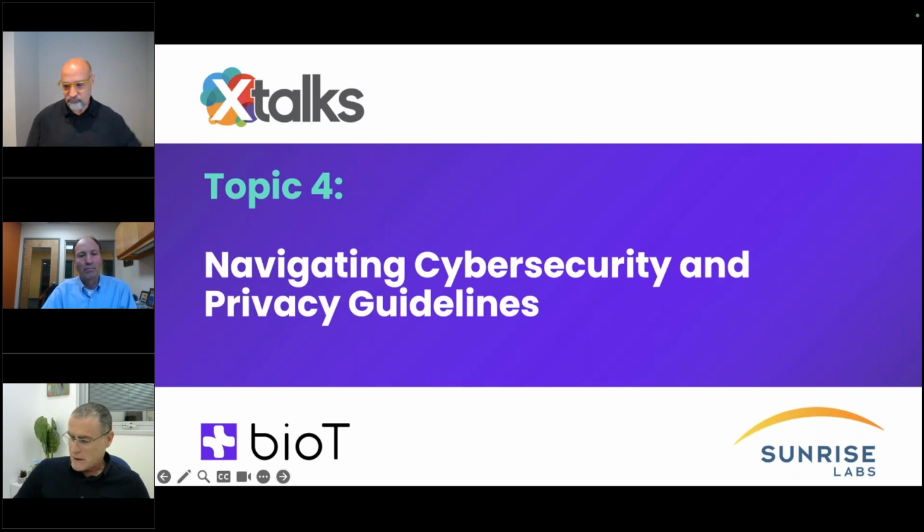Yeah, this is a hot topic, and we discussed it in our previous webinar. It continues to roll and change, and FDA is constantly modifying some of it. So maybe first, let's understand what a cyber device is. The FDA defines it based on the latest guidance, and basically they say that any device that has software, or even only firmware, and has some communication interfaces, which can be a serial interface or a USB interface, is considered a cyber device, and hence needs to be protected.